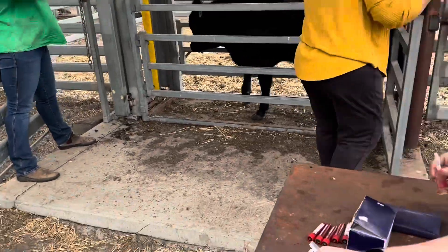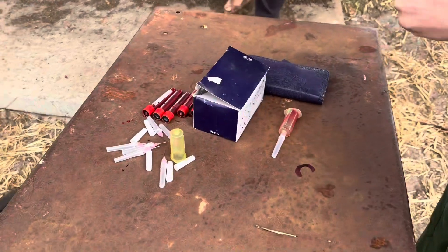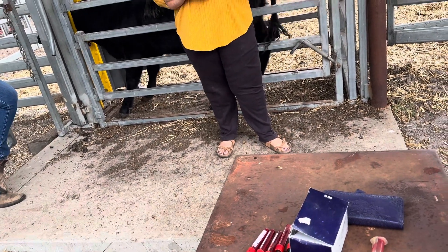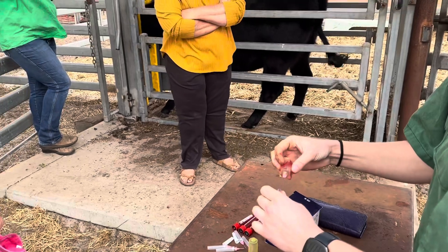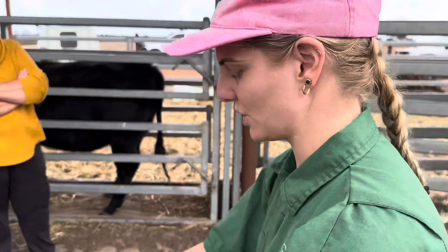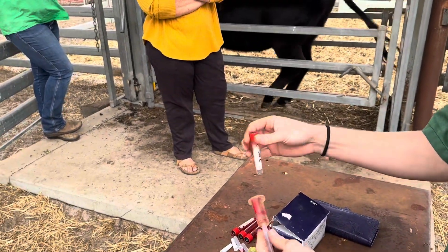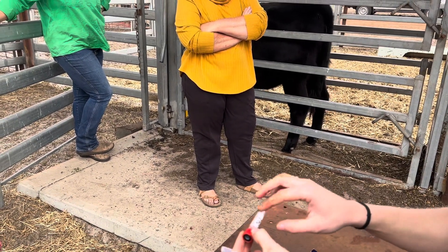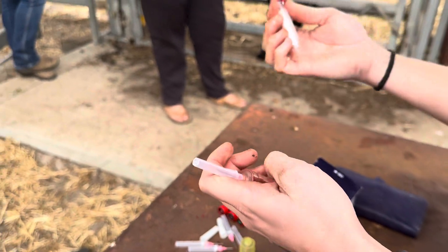Come and learn and ask questions. I'm Zara — come on in. You want to show her how to load the needle on? Sure. The double-ended needle — see why they're called double-ended? Pokey at both ends. Take the white cap off — twist it and take the white cap off. Then twist the pink bit into the back cap holder, and you've got a blood tube. This has got a vacuum seal on it, which means if you puncture it, it'll suck in whatever you've got coming through the needle. If I puncture it now, it'll suck in air and then we can't use it for blood.